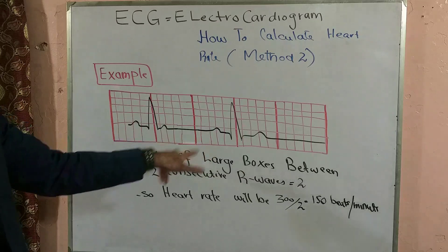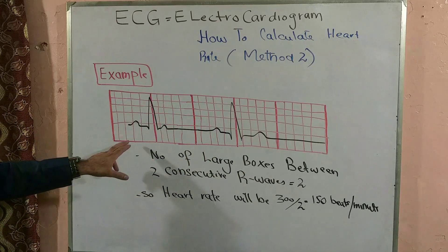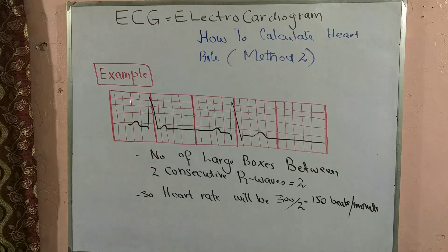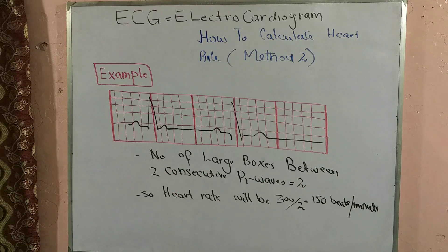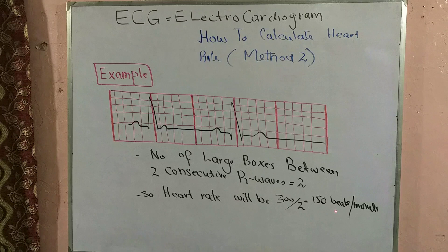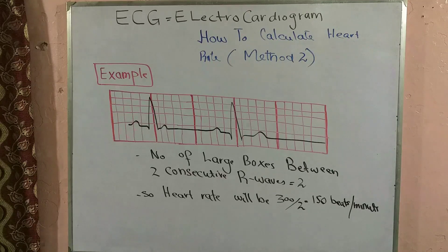Here is another ECG strip example. The large boxes are separated by bold red lines and the small boxes by thin red lines. Identifying the QRS complexes, the tallest positive deflection is the R wave. Counting the large boxes between two consecutive R waves, there are only two. Dividing 300 by 2 gives a heart rate of 150 beats per minute. This is how Method 2 works — it's not that difficult to remember.